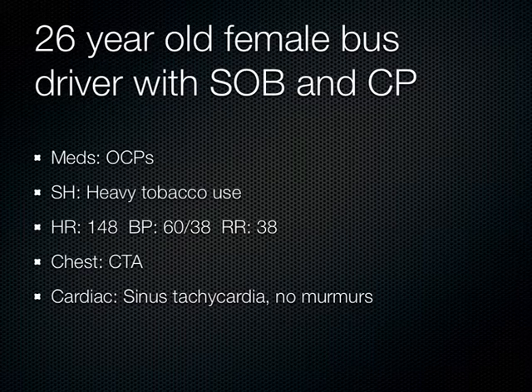Pulmonary embolism? Anybody disagree with that? No? You've already seen this lecture? All the interns have seen it. That's right. Maybe I shouldn't do this lecture then. Yeah? All right. But we all disagree. You all disagree. That's good. I agree with y'all. You agree with the Yalda?